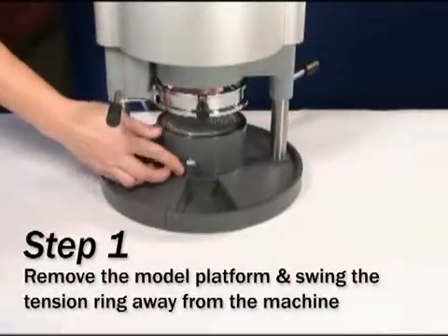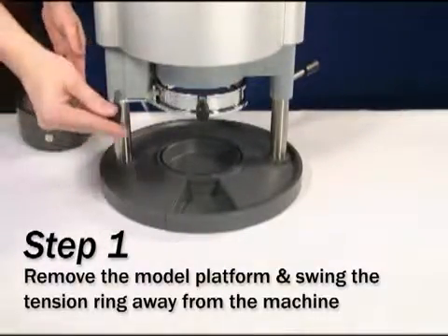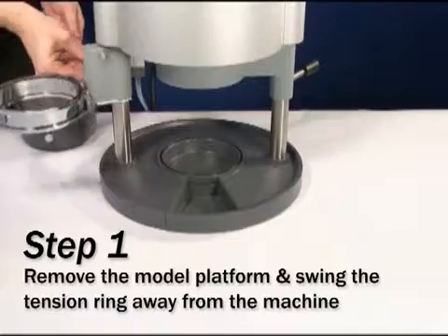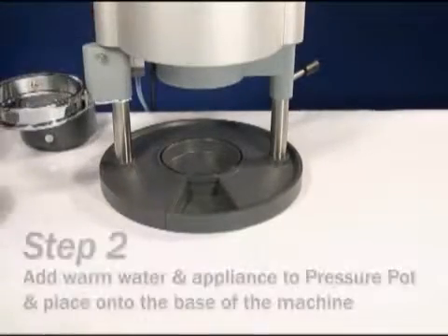Remove the entire model platform off of the base of the drufomat scan. Using the handle on the left, swing the tension ring away from the drufomat scan. You will not engage this ring when using the pressure pot.